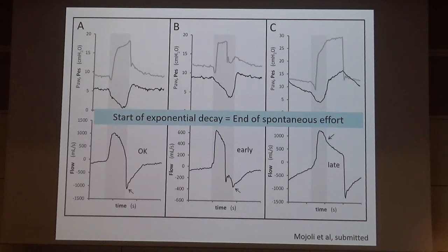And we can use this information to check whether the cycling off of our ventilator is at the right time, too early, or delayed.